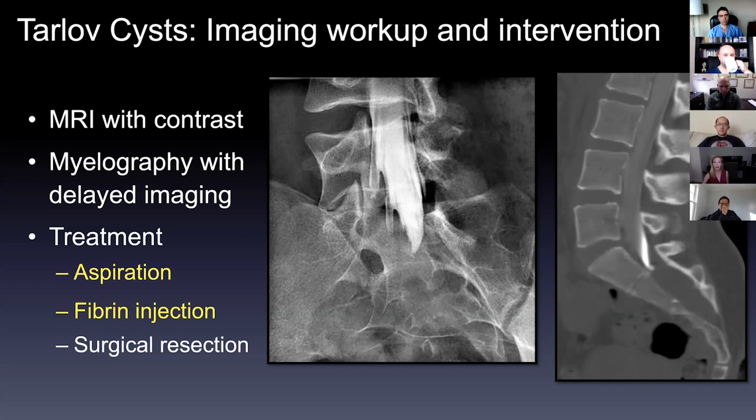Next, we do myelography. So this is under fluoro. And those people who say they don't like myelograms, look at this gorgeous, gorgeous picture. This is just beautiful. Anyway, so I'm watching it under fluoro. I inject my contrast. I'm watching to make sure the cyst is down here. I want to make sure there's no immediate filling of that cyst, because that means the connection is too wide.